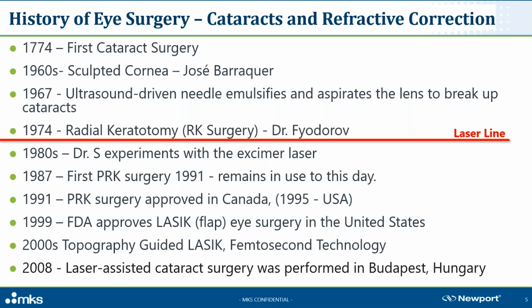With continued advancements in technology, specialists now map the eye using a laser topography method for advanced accuracy, and they use ultra-short femtosecond pulses to limit heating, and they claim no recovery time procedures. These refractive procedures have been so successful that cataract surgeries include refractive corneal reshaping while they're in there. Cataract surgery uses laser pulses to break up the opaque buildup and has been considered one of the most successful treatments of all time in terms of completely correcting or reversing the cloudy vision caused by cataracts due to aging. Much better than sticking a needle in your eye.